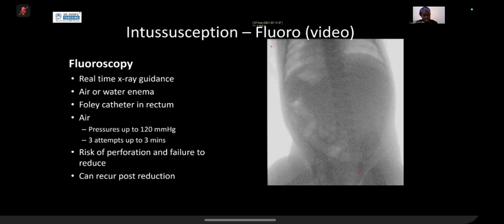And if I think there's a lead point when I'm doing the ultrasound, you can have a discussion with your surgeon. Some would still like you to try because, like I said, you've pushed it round as far as you can and then it makes their operation easier, or some will take them straight to theatre. It's just a conversation to have with them.